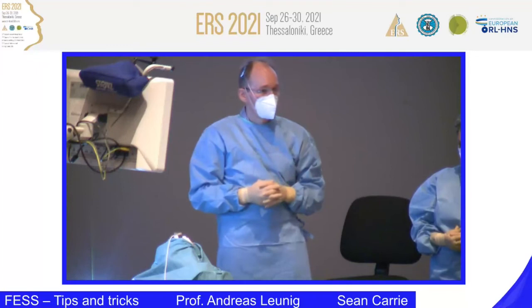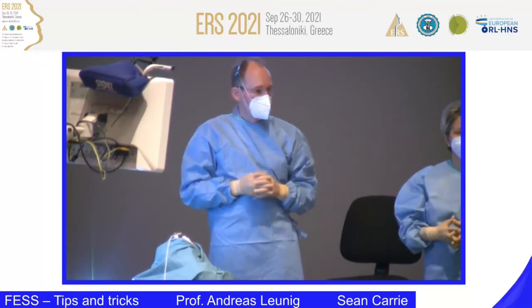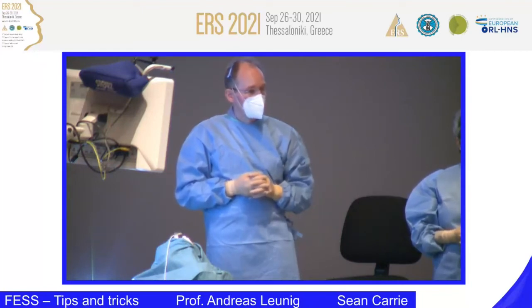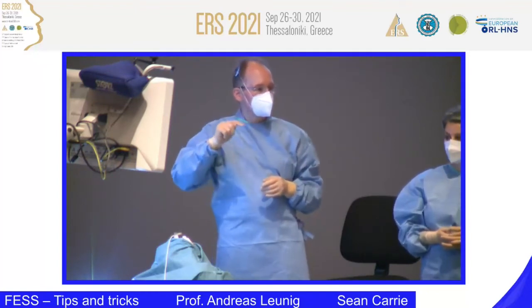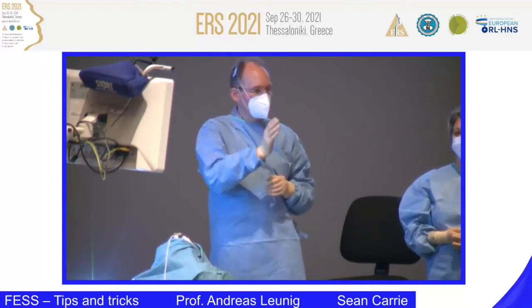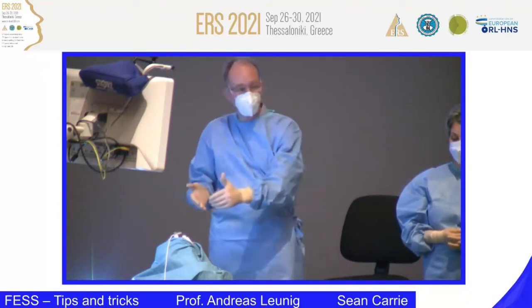Okay. What I wanted to say was that one has to go through the agger nasi in 86 to 90% of the time. Yeah, you're right, that's what I said. Unless we do that, we'll probably never be able to open the frontal sinus. You're right. There's a nice paper published by Peter Wormald, the agger nasi cell, the key to understanding the approach to the frontal sinus, and that's exactly what you said. You have to open the agger nasi, and when you understand the uncinate process and agger nasi, you will be able to do it. This is training, and holding the endoscope in the right position.